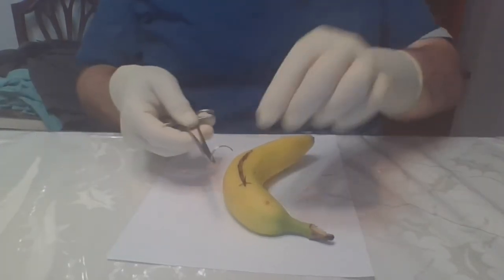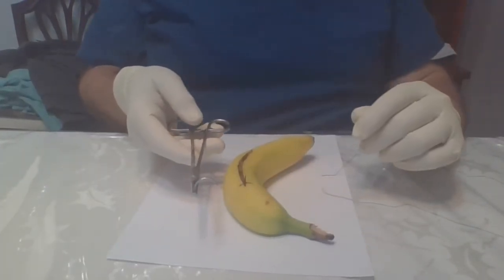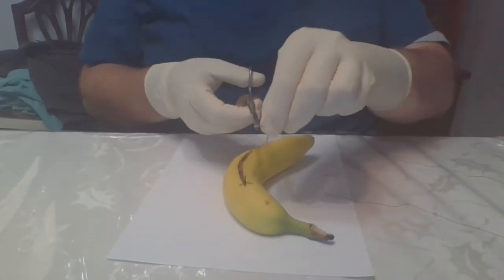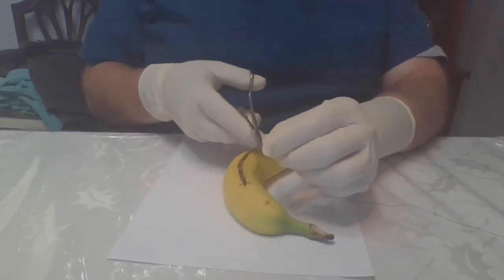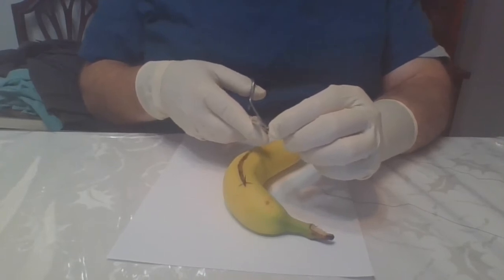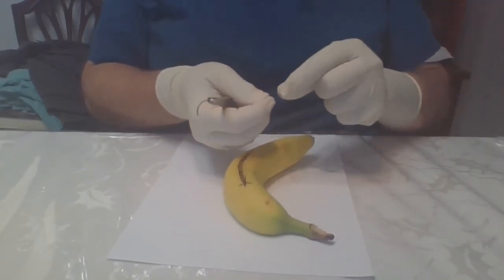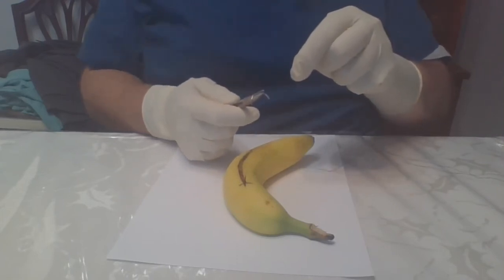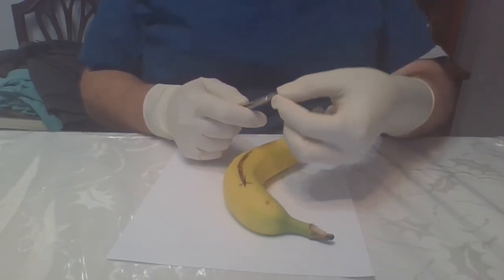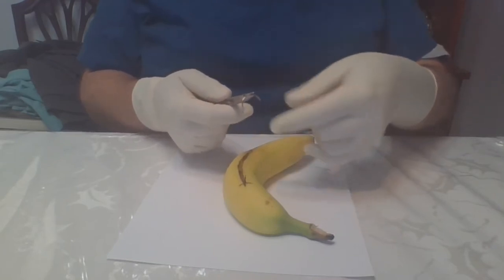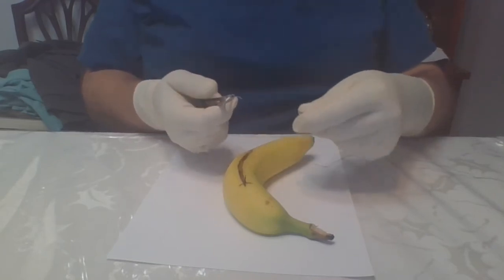And as you see, when the doctor hands this back to you, it's usually going to be like that. So we need to reset the needle. Take the silk through the eye. Three to four inches excess.